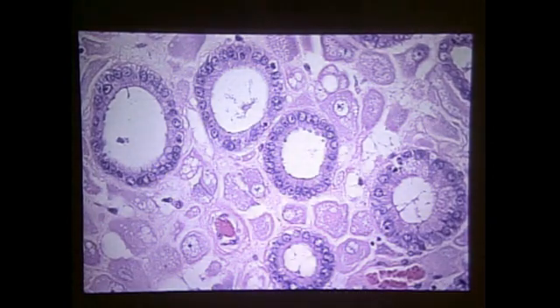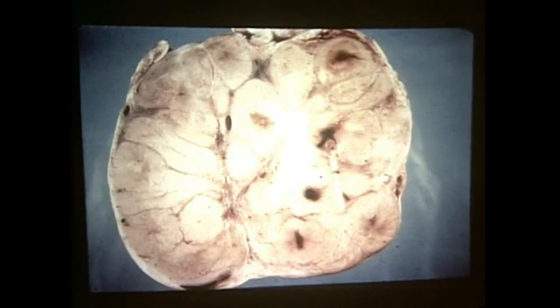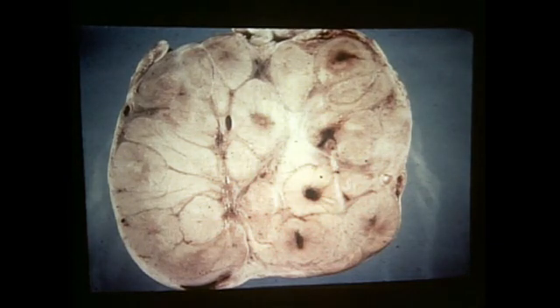Microscopically, here again another set of endometrial cups. Microscopically, they are characterized by a trophoblast-like appearance, separating endometrial glands, with a prominent nucleus and very prominent eosinophilic cytoplasm. They spontaneously regress somewhere around day 120 of gestation, and at that time one can see associated with these structures many lymphocytes, which should not be confused again with a placentitis.